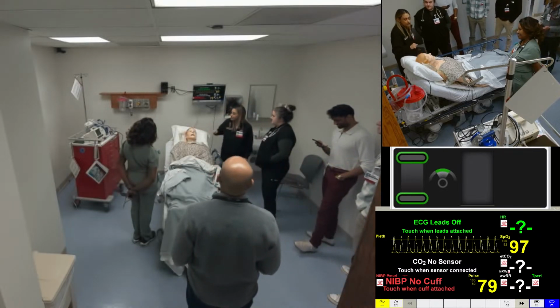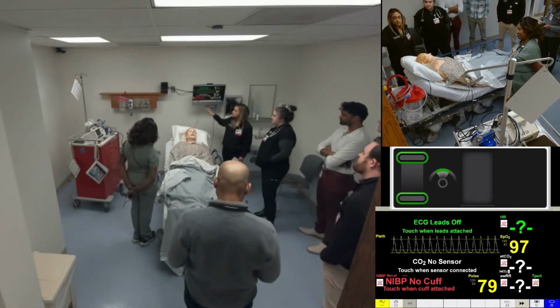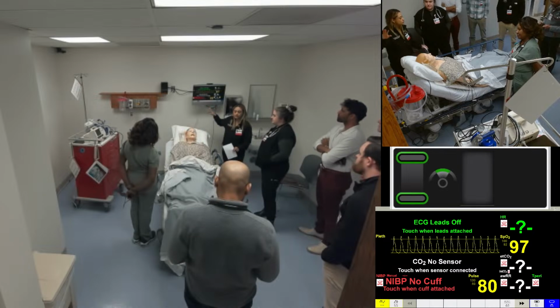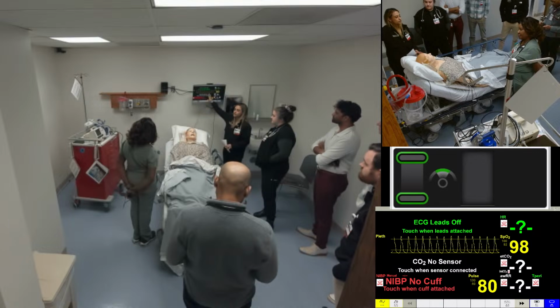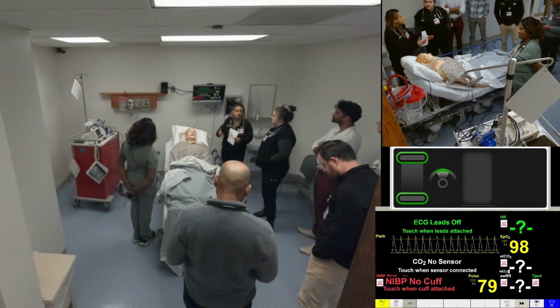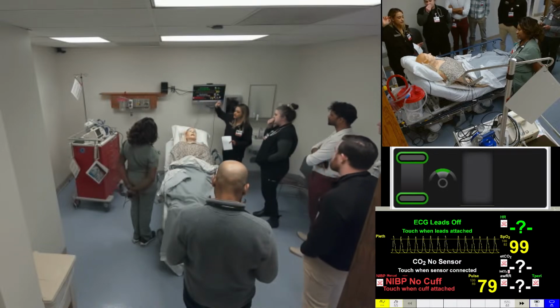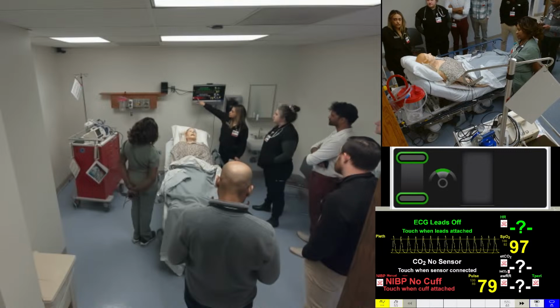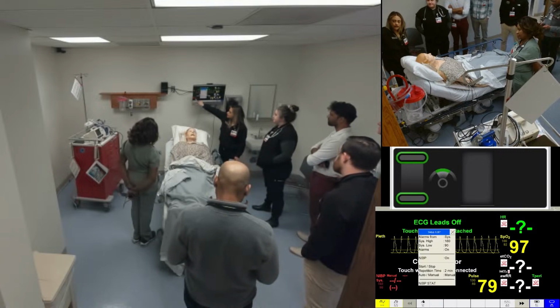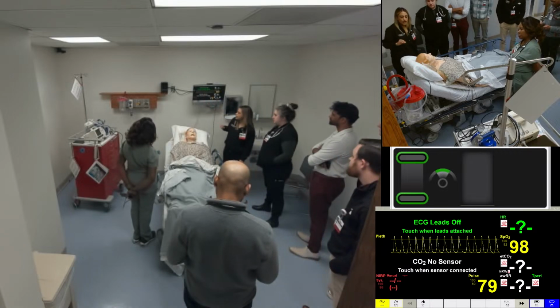He is awake, right? Remember that all of this is interactive for you. So if you're seeing your patient be in a distress type of thing, remember your vitals. I'm not going to give you vitals. It is your job to get a blood pressure cuff, to make sure that the leads run so that you can identify things. If you want a cycle of blood pressure, you just have to touch, and then you tell it to start right there. So that's pretty easy, and then everything else should make sense here.